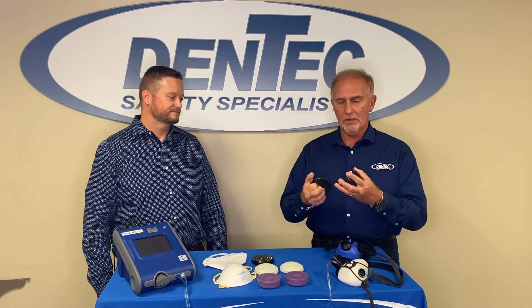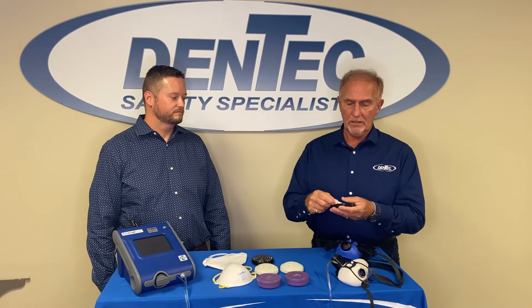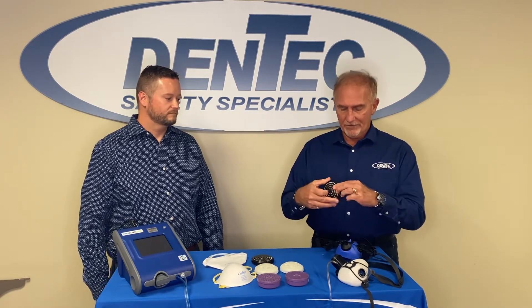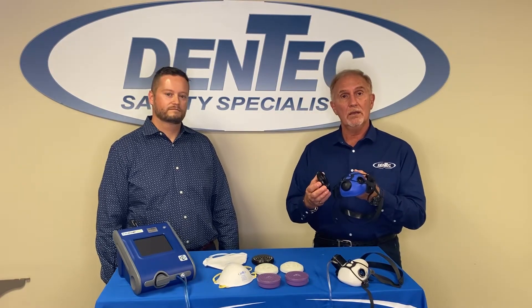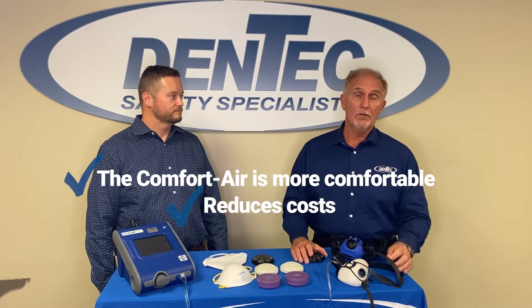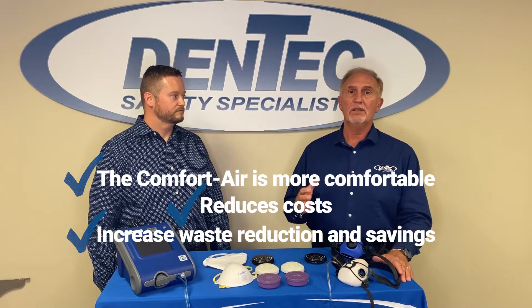This plastic housing allows us to mount our N95 filters that we also make in Lenexa, Kansas from U.S. raw materials. We can attach it to any one of our half masks or full face pieces and we create an N95 reusable solution. It's more comfortable, it reduces cost by an enormous amount, and the environmental savings is even greater.